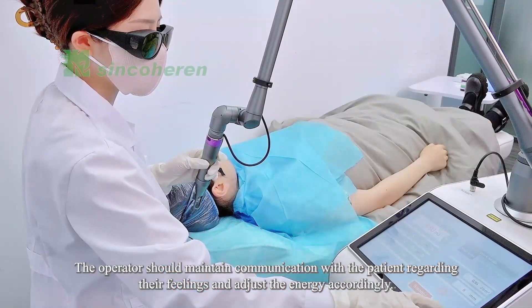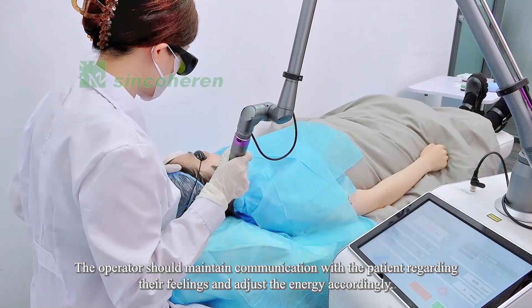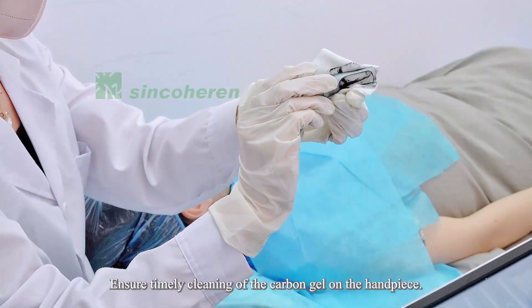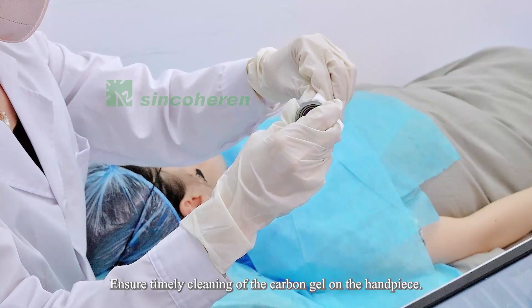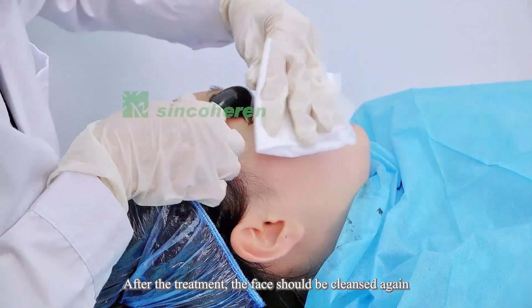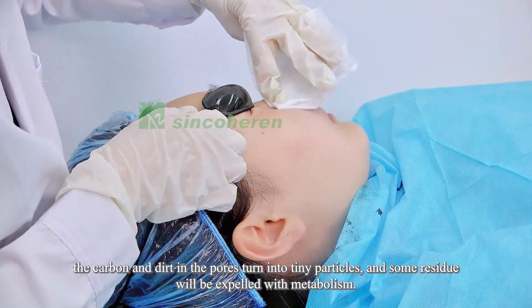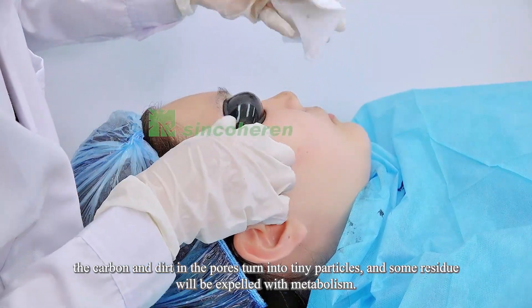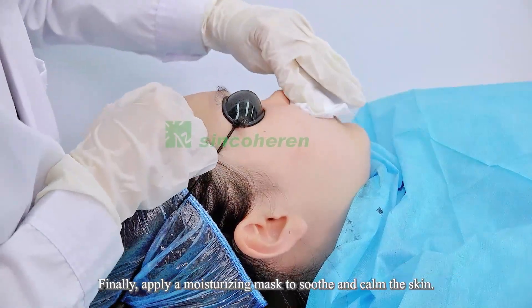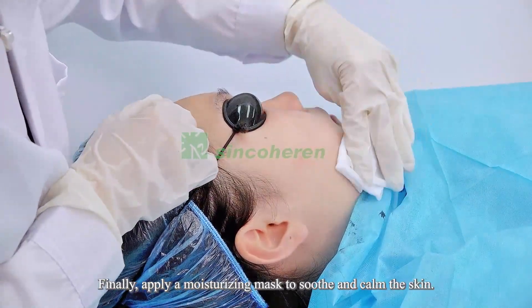The treatment endpoint is when the skin appears slightly red or warm. Simultaneously, another hand assists in smoothing out areas with wrinkles such as deep wrinkles. The operator should maintain communication with the patient regarding their feelings and adjust the energy accordingly. Ensure timely cleaning of the carbon gel on the handpiece. After the treatment, the face should be cleansed again; the carbon and dirt in the pores turn into tiny particles and some residue will be expelled with metabolism. Finally, apply a moisturizing mask to soothe and calm the skin.